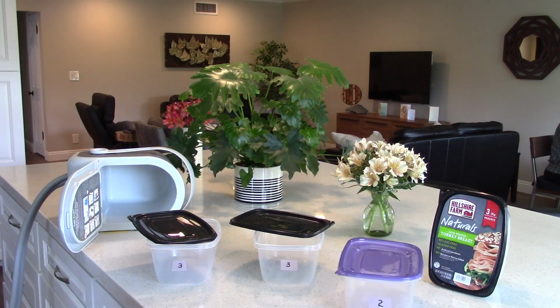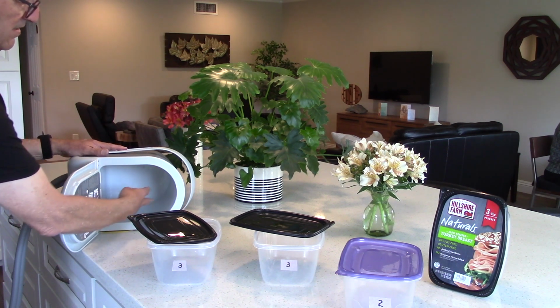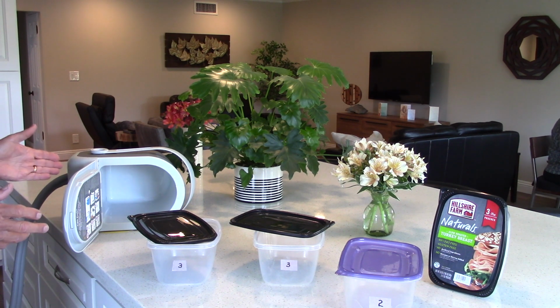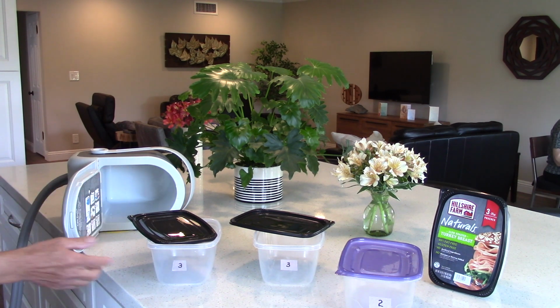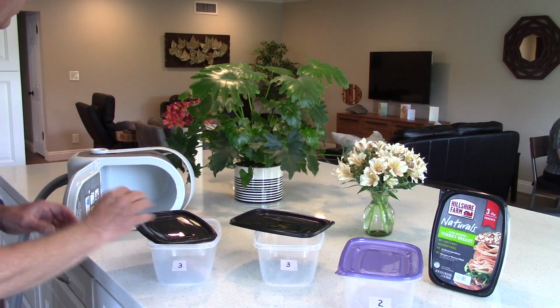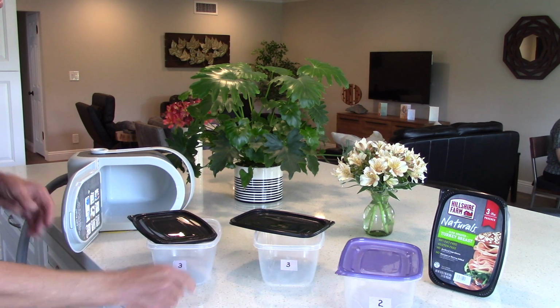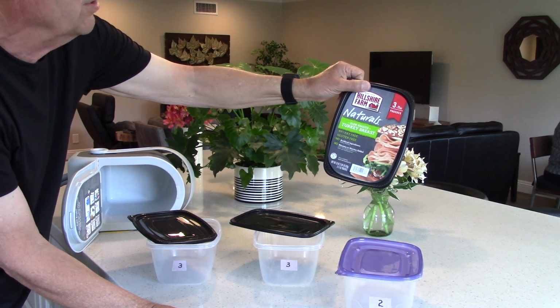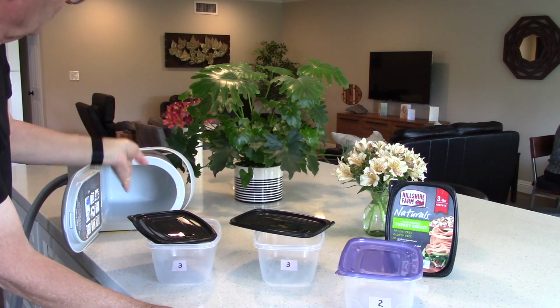One of the biggest problems you're going to run into is this chamber that you're putting ice into cannot work very well with crushed ice or ice cubes. They would melt way too fast. So what you really need to do is get some of these plastic tubs and freeze some large chunks of ice, and they fit perfectly in here, 2 of them. These here are coming from this product called Hillshire Farms turkey breast sliced meat, Costco, and it just works perfect size for this unit.